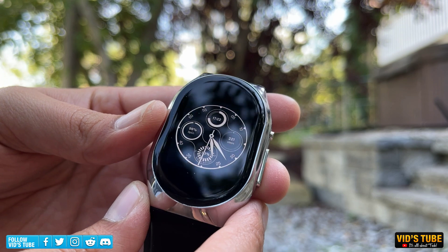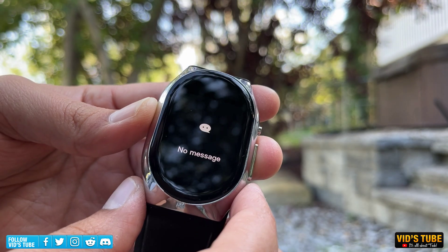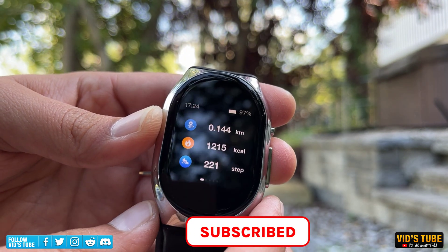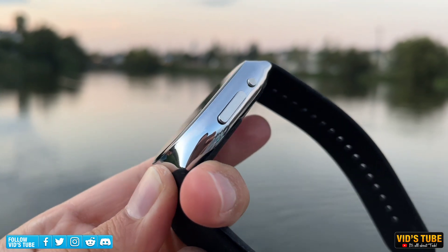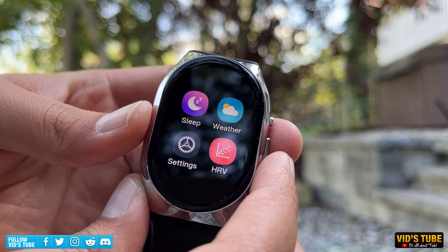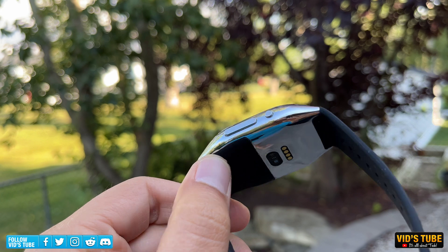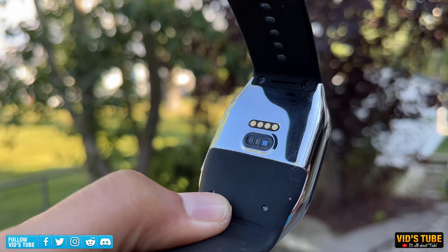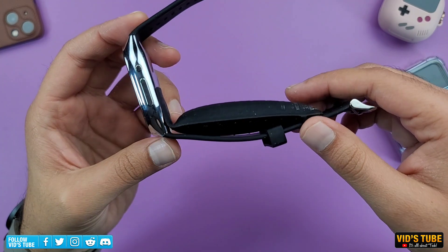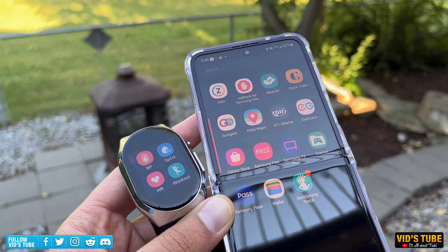The navigation and UI of this watch is super easy to use. Slide down to enter quick settings, slide up from the main watch face to access notifications, swipe left to access widgets, and swipe right to access health stats. There are two physical buttons on the right: the top round button goes back and turns off the screen, and the bottom button accesses the menu. This watch does not have a built-in speaker or microphone. At the back, it has charging pins with a heart rate and SpO2 sensor. The bottom belt has two layers — the innermost being the inflatable cuff.